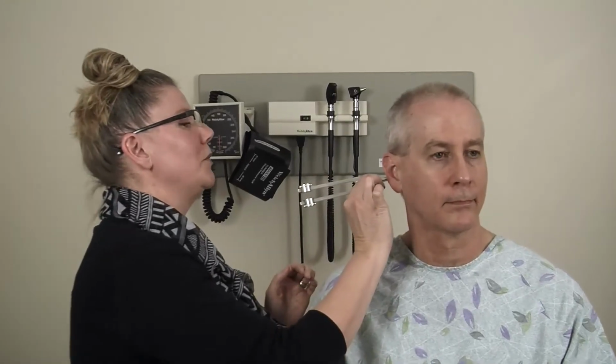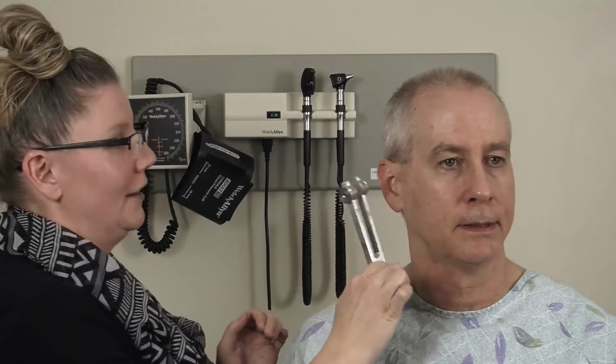So I'm going to strike the tuning fork. Tell me when you no longer hear it. No. And can you still hear it? Yes. Okay. So that would be considered a normal Rinne test in which air conduction is greater than bone conduction. That's what you would expect.